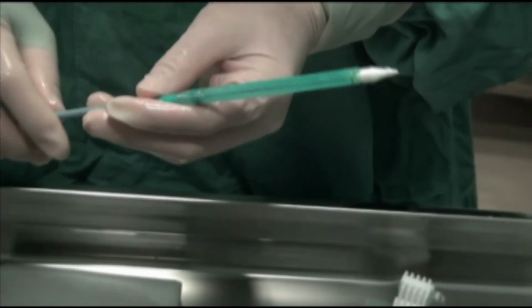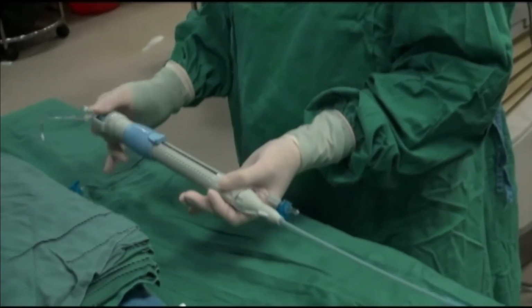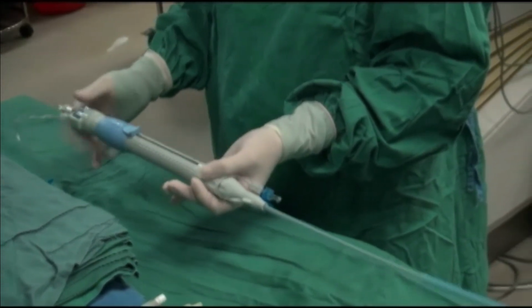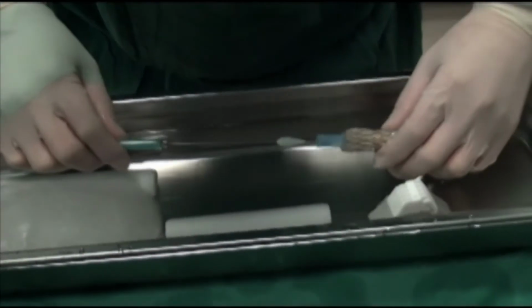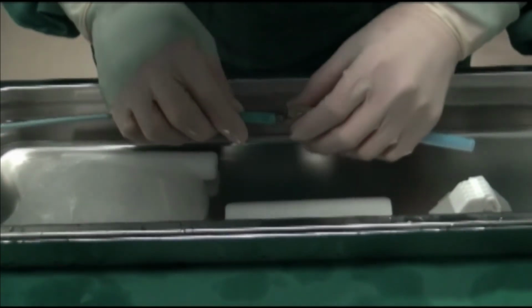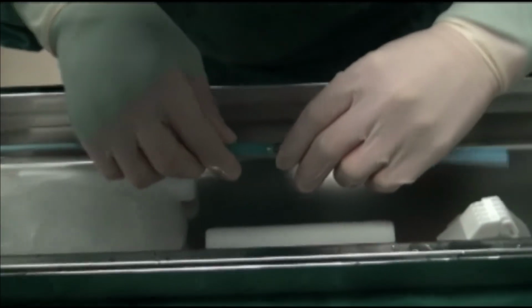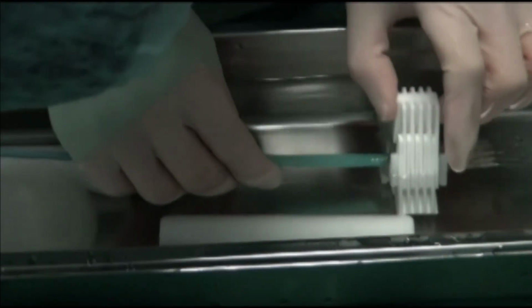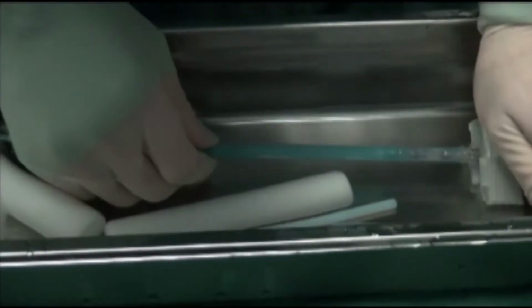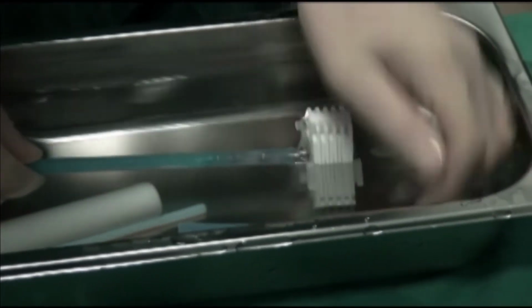This is the delivery sheath with the cover. So first we will put the cover back and put the valve on, then we clamp it again. It will be in a locker. There are 2 legs for the lock for the delivery cable. Then we crimp, and we push the cover sheath forward and fully cover the whole valve.